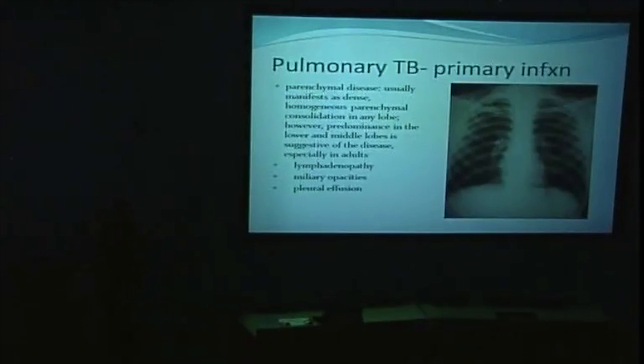Let's start with chest X-ray. Obviously, that is still the mainstay of imaging of the lungs. It's the most commonly performed imaging procedure at this and probably most of the hospitals. It's quite a low radiation dose, equivalent to about 4 days background radiation. So it's a good test for anything from weight loss to itching to anything.